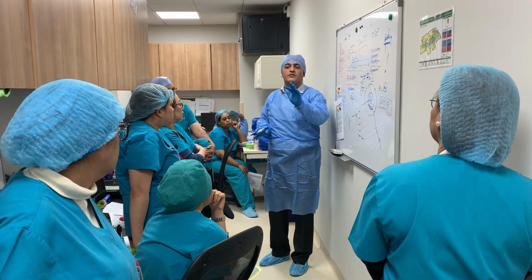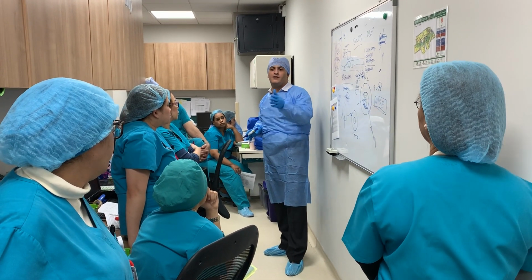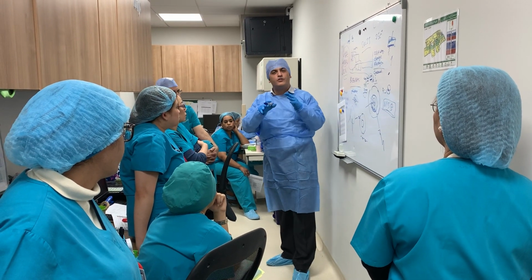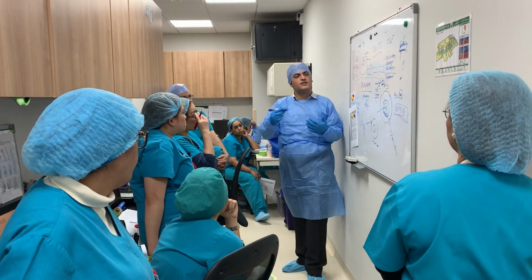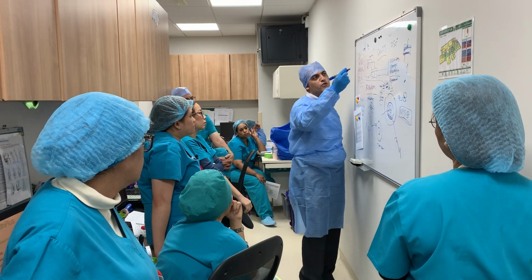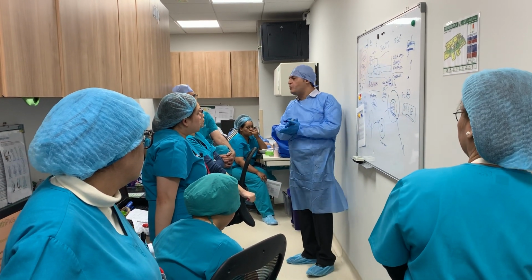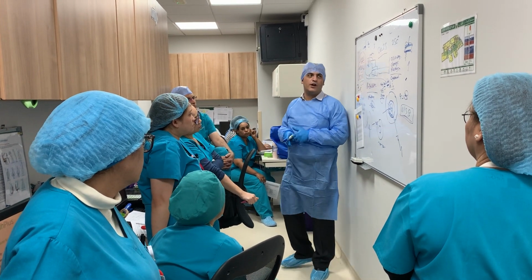Just to make sure. Suppose something happens and you cannot do the work for the rest of the month; you will have to push your work into the next month. So in order to be safe and keep it for 4 to 5 months in storage, you take the 100 microliters that you are about to use, or the 200 microliters, and wash them 3 times. Three times, very important, because the sodium azide would be completely washed off the particles once you do it the third time. Okay, all right.